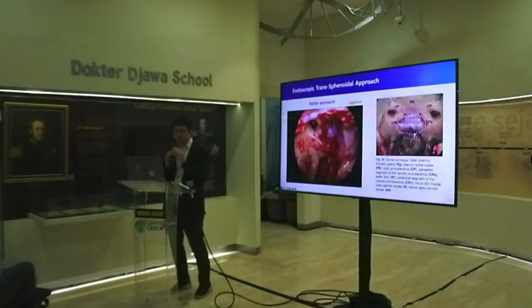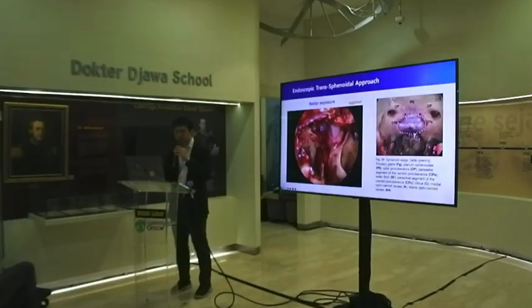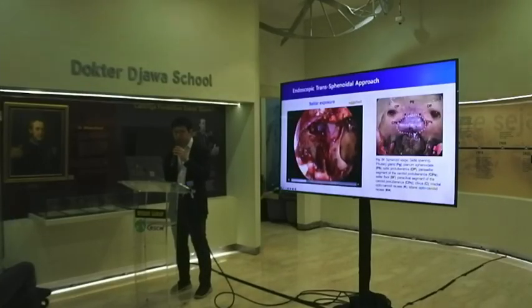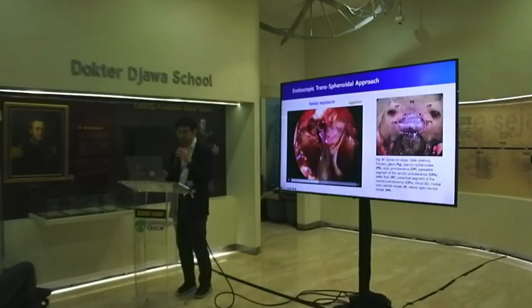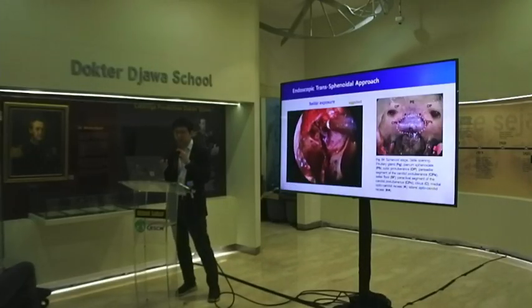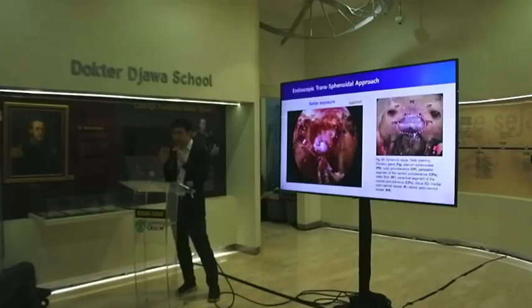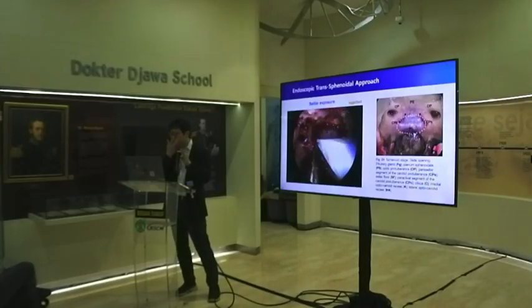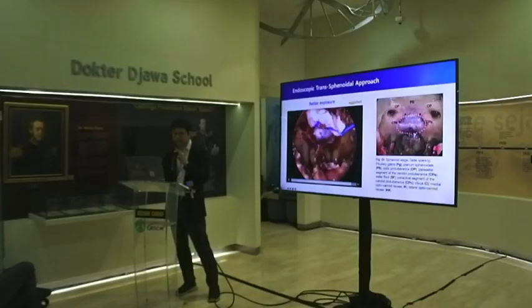This is how to proceed after drilling out all the intersinus septum. This is the sellar exposure. And after removing the sellar floor by drilling out, you should make the sellar floor bone like an eggshell. After making it eggshell-thin, the sellar floor bone can be removed very easily like this. So that's how we prepare for the main procedure.